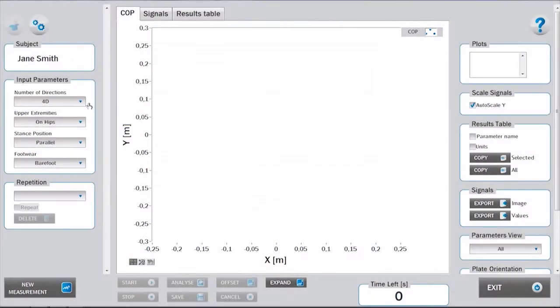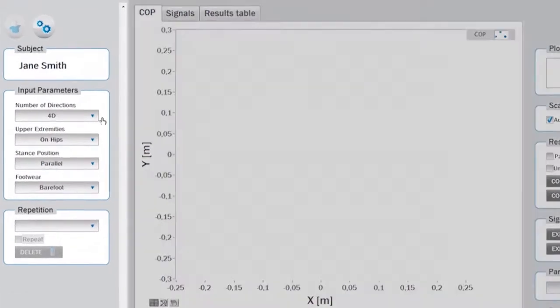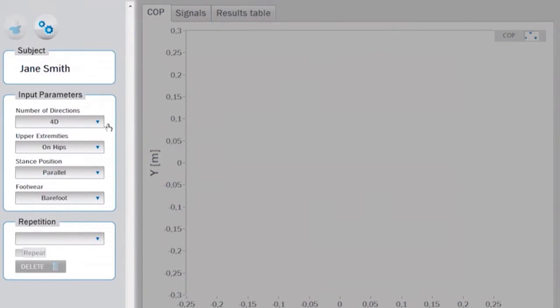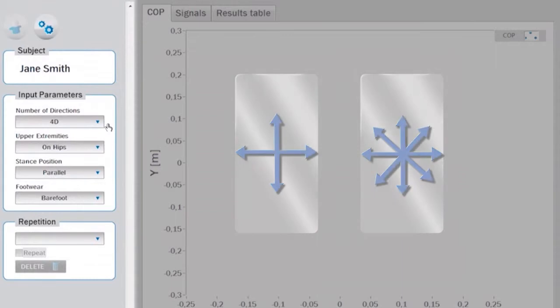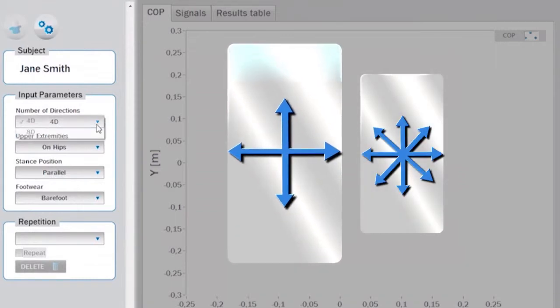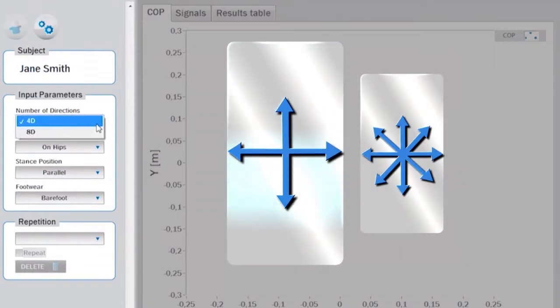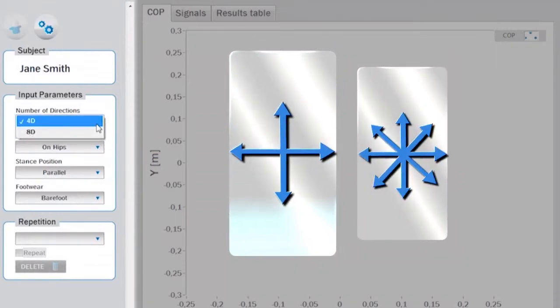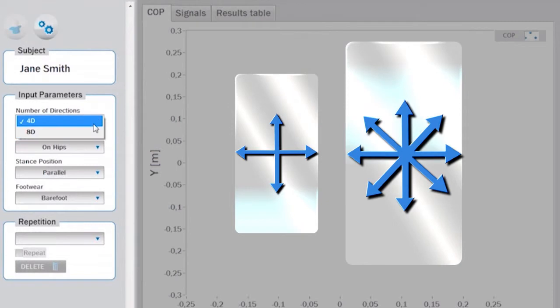Before starting the measurement, appropriate input parameters must be determined in the setup panel. First, the number of directions in which the test is performed must be chosen. You can choose between four directions or eight directions.